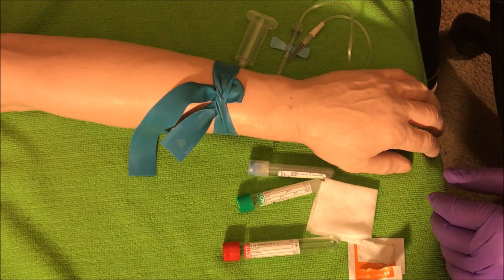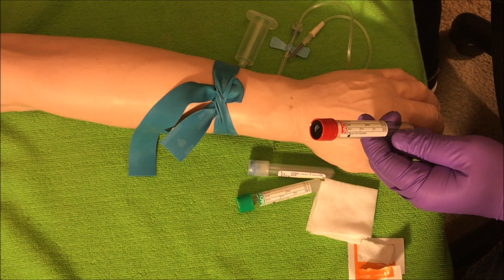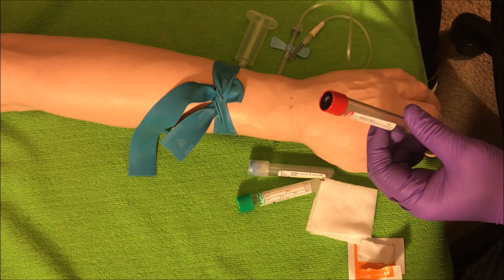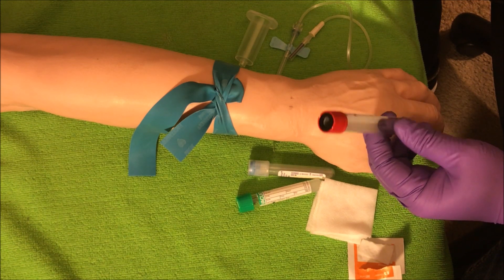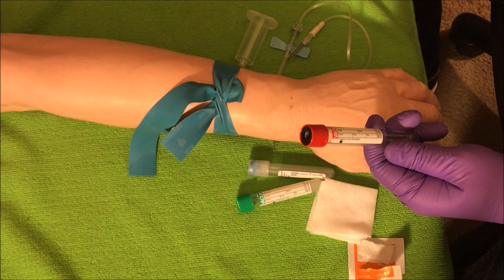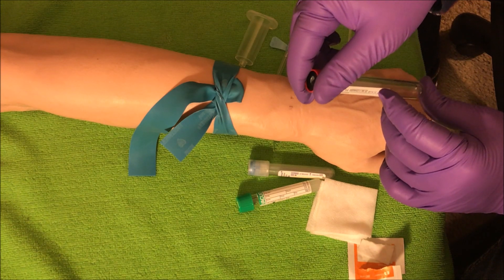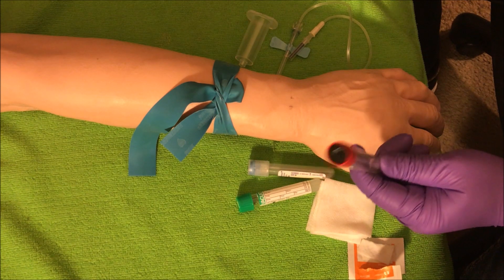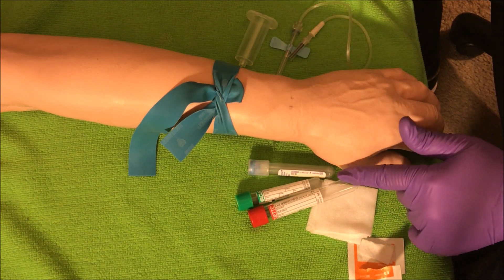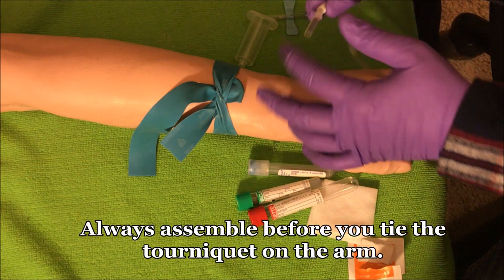If I'm dealing with a neonate or infant, I use a butterfly whether on the hand or the break of the elbow, but I don't want to use large adult-sized tubes. The vacuum is stronger on adult tubes, and using them on a neonate takes too much blood out, which can cause serious problems. I have a video on blood cultures and finger sticks and heel sticks on infants with a chart on how much blood we're allowed to take. We have tubes that are a quarter of this size for children seven to eight years and under — make sure to use those, not large adult vacuum tubes.